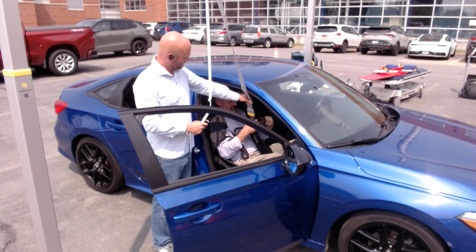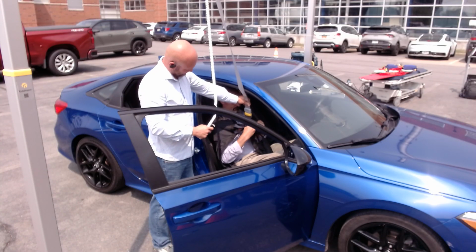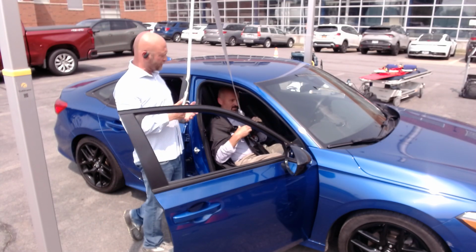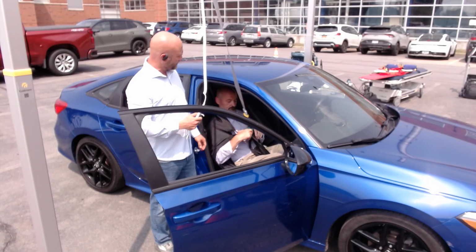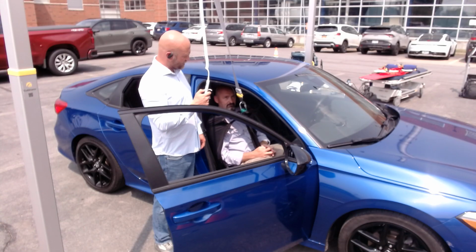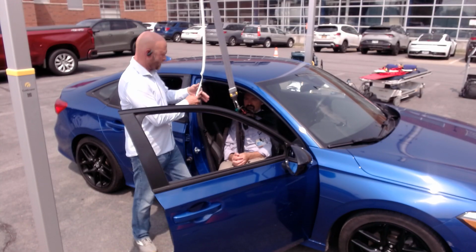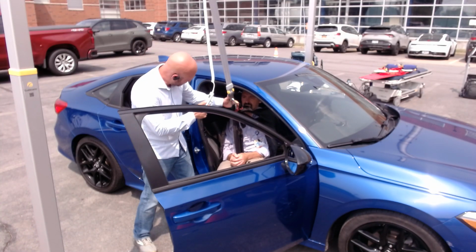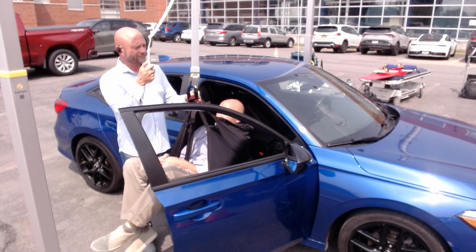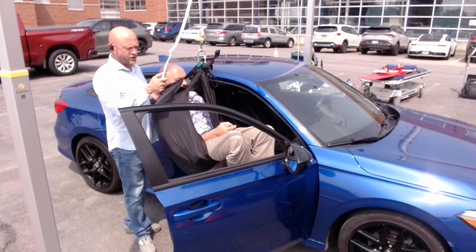Again, super helpful patient. And again, you would have a wheelchair out here or a stretcher to get the patient onto at this point. So now we're all hooked up. As we start to lift up, the weight's going to start coming off at his bottom. I can then help rotate the side, making sure we have plenty of clearance for his head. As this goes up, you can see the pendulum action. Pulls him right out of there. He's here. We can turn him. We can put him into the wheelchair.